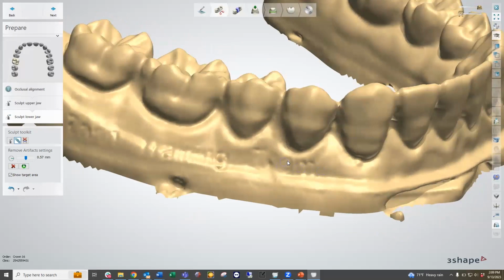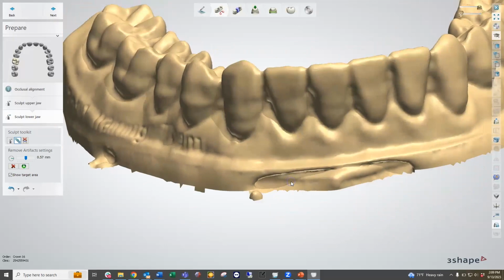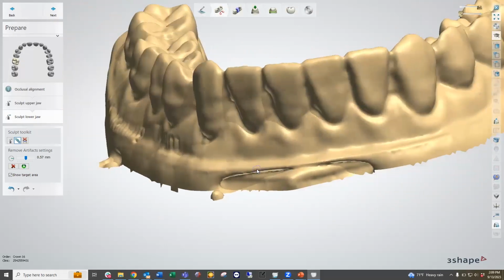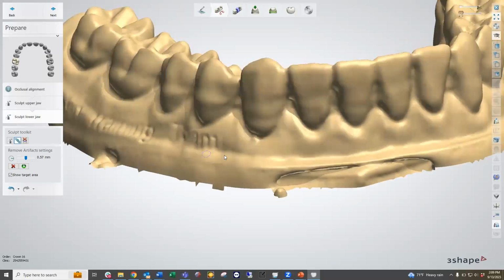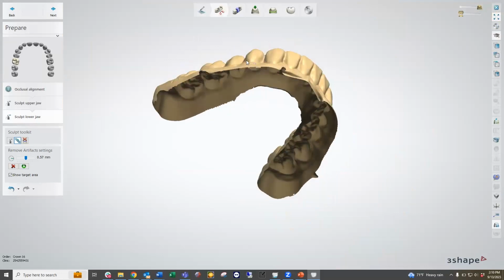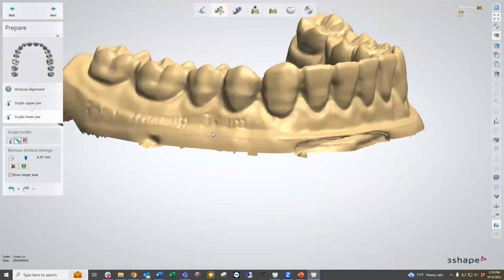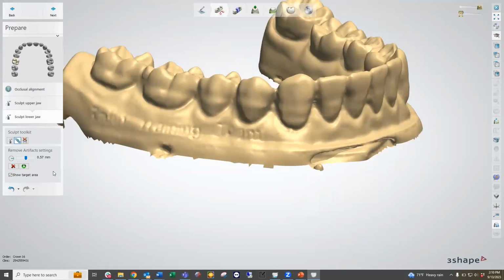It finds the median between those areas and smooths it out and prevents any sort of inverted triangles or anything like that that would normally cause issues with our scans to be flattened out and reverse the normal so that they're correct. If anybody doesn't know what a normal is, it's basically the difference between looking at the outside of the model versus the inside of the model. And it's basically just the software dictating which side's inside versus which side's outside. So again, I can use this option to go ahead and trim up or further prepare our models.